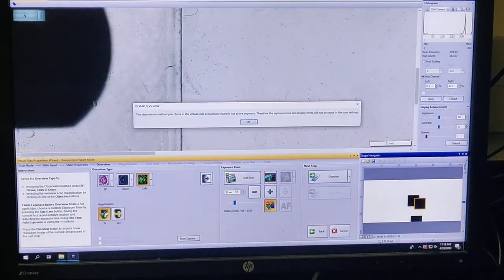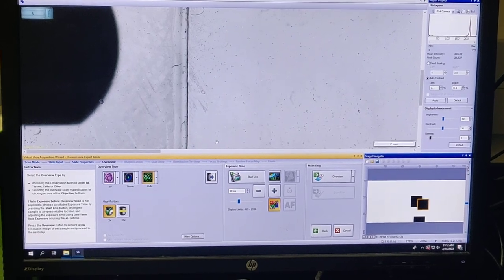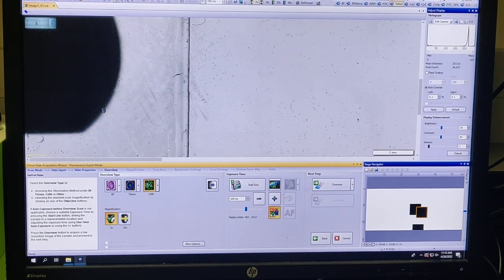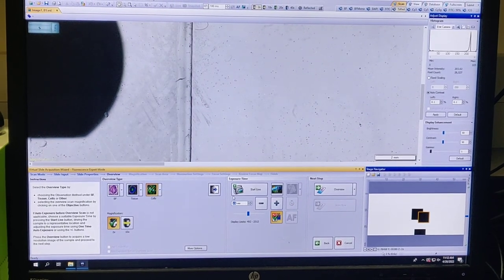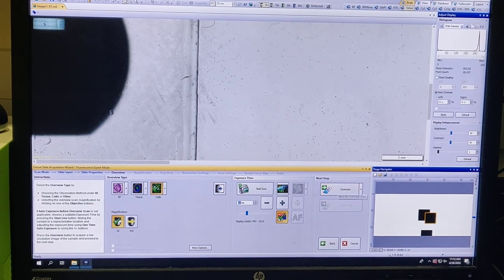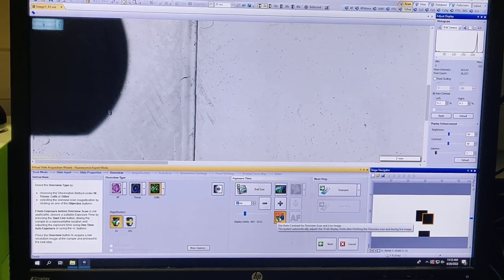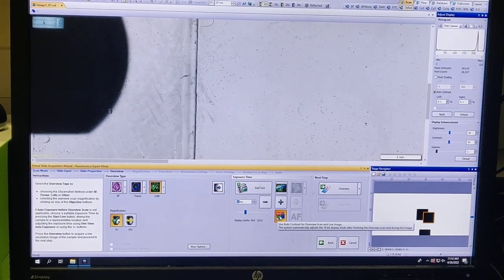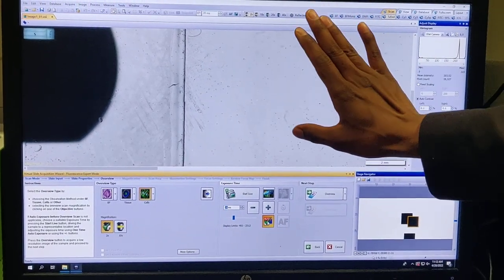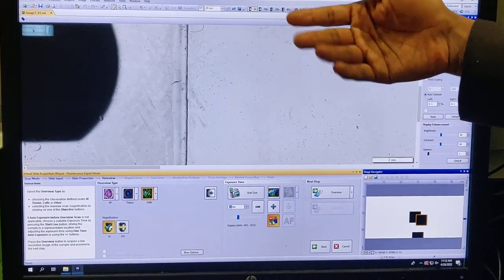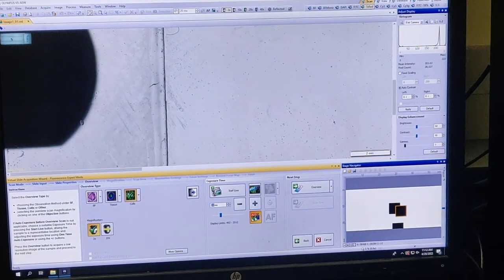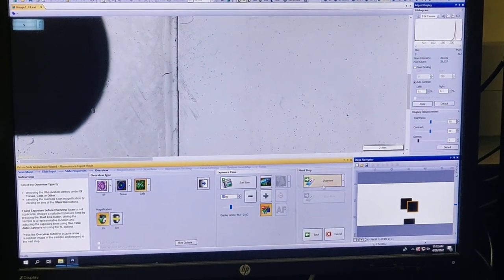I'll use 20 milliseconds and select Texas Red. I always keep auto contrast on because while imaging, the view might look dim or bright, but auto contrast adjusts it to the right range so I can see the object and draw the region of interest (ROI).